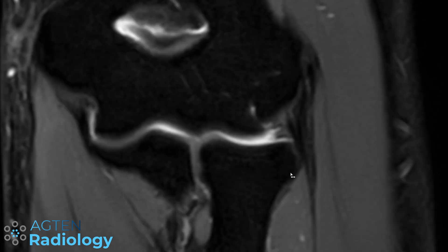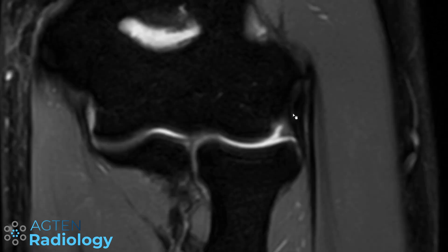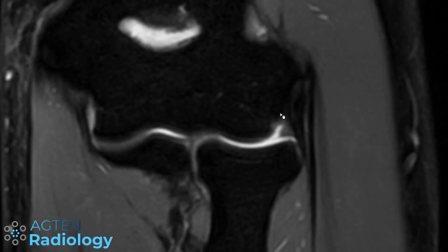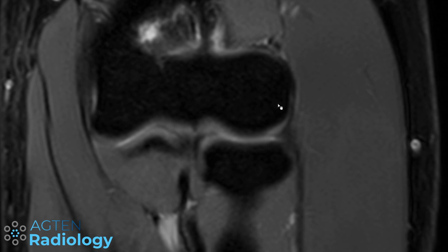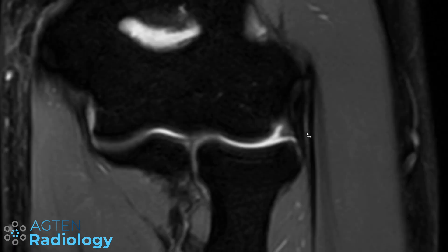This is the course that the lateral ulnar collateral ligament is taking. To summarize: anteriorly lies the radial collateral ligament and posteriorly is the lateral ulnar collateral ligament. Frequently you cannot really separate these two ligaments from each other — just keep in mind that the more anterior one is the radial ligament and the posterior one is the LUCL. Above the ligaments are the extensor tendons, which are not the topic of today's video.